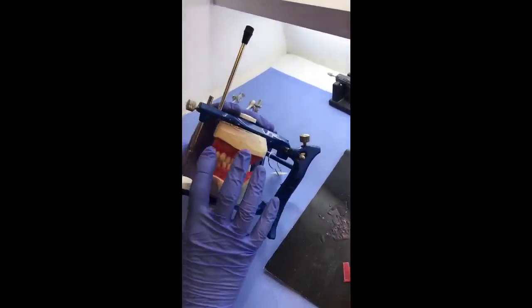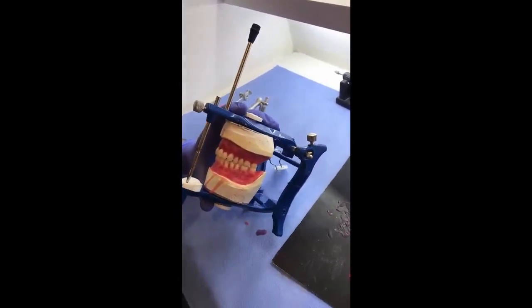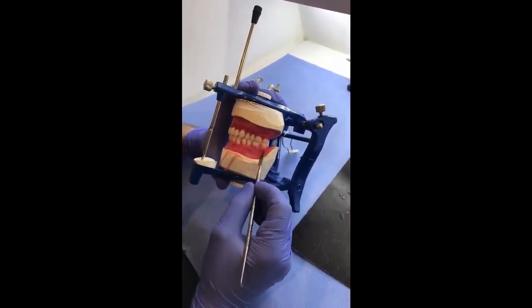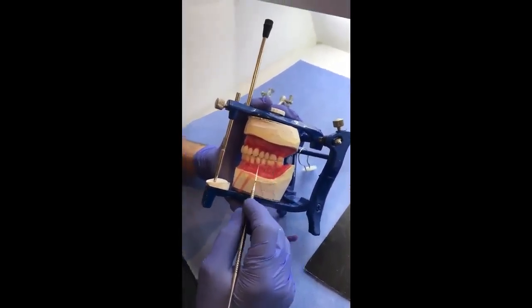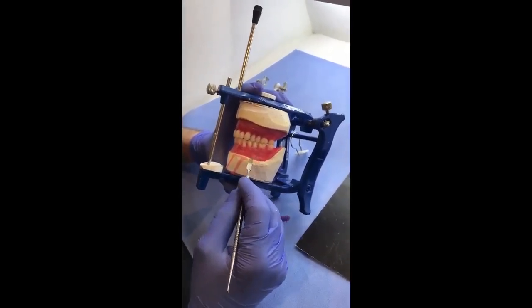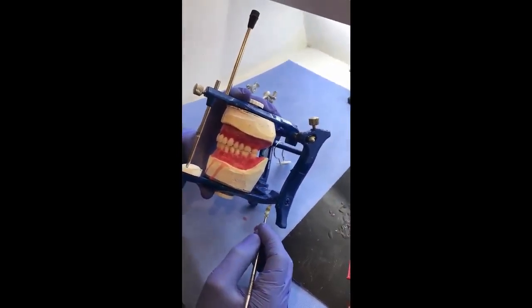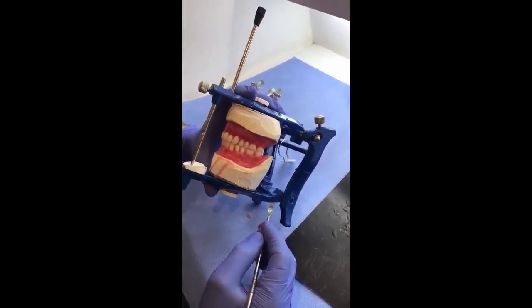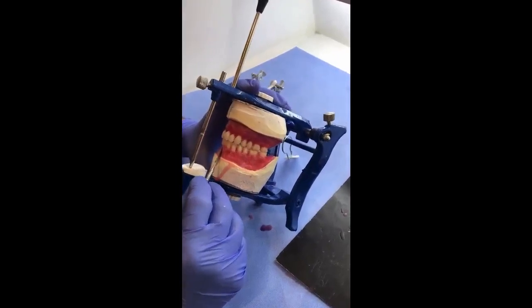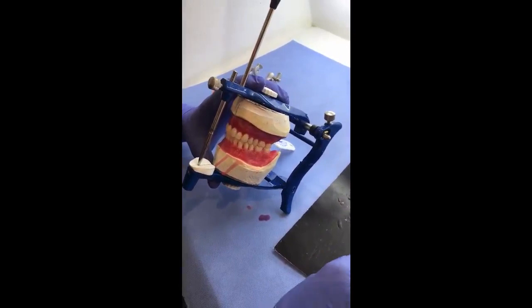Now, the development of the polished surface is very important. The polished surface has very important functions. It improves tissue tolerance, the tissue surrounding the denture, and it improves denture stability. It improves denture retention by achieving muscular balance. Also, it is very important for denture appearance and subsequently patient acceptance, improving phonetics of the patient.